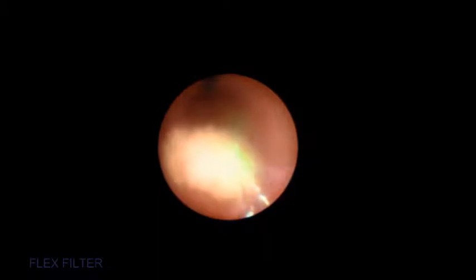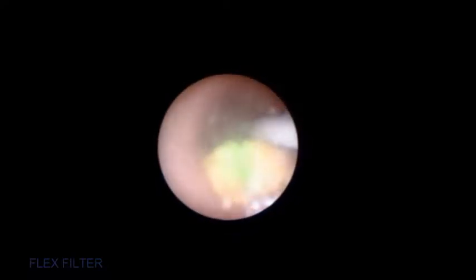To avoid proximal migration, the stone is sandwiched between the ureteral wall and the laser fiber, with the goal to chip and dust the fragments of the stone from one side to the other side. If there are large fragments, they are grasped with the stone basket and retrieved under vision for stone analysis. It is critical to ensure that all of the stones are fragmented or dusted to a small particle and retrieved with a basket under fluoroscopy vision.